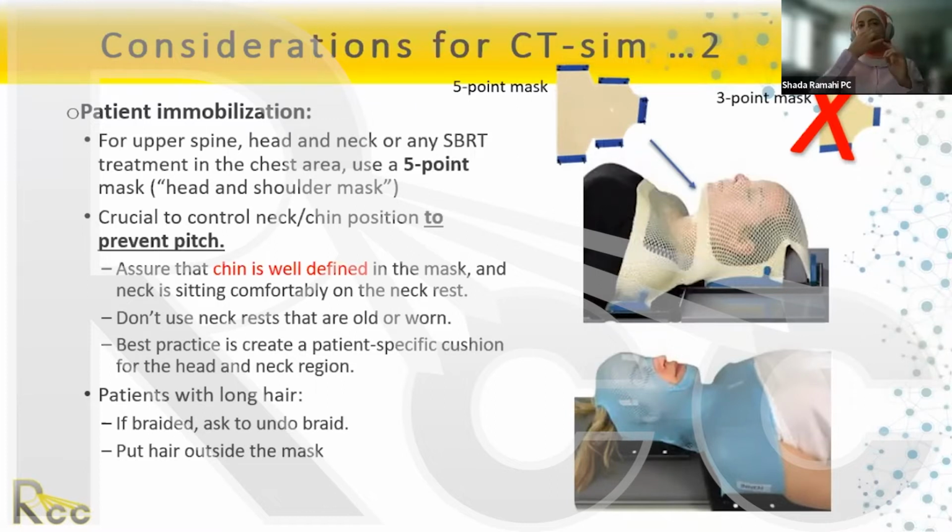Nose, you can do the nose, but it's not a must. You can actually open the nose area if people need to breathe better. The ears, it doesn't give you, oops.